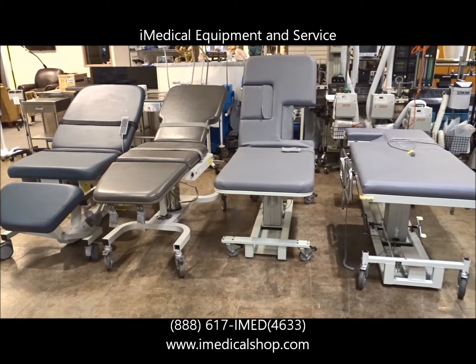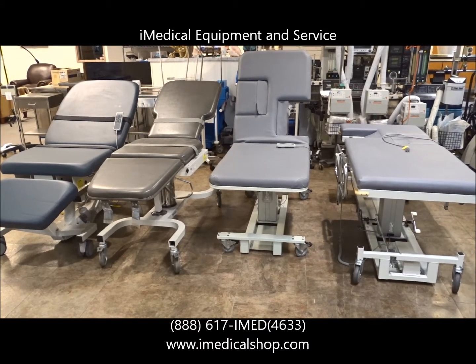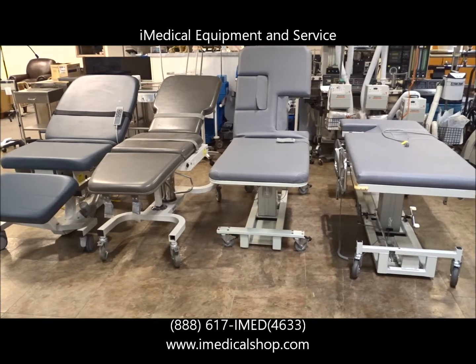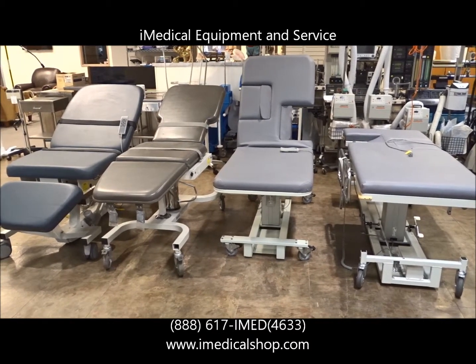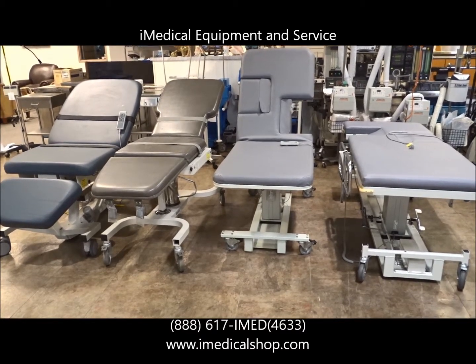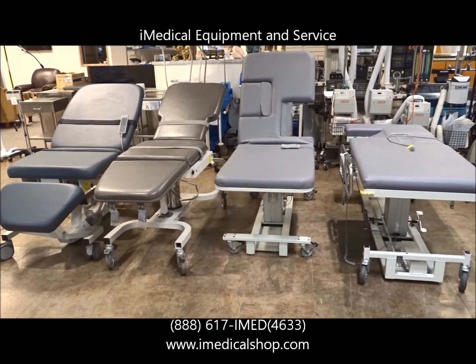If you're looking for ultrasound equipment, we carry a wide range of ultrasounds — both black and white and color, console units, portable units — everything you need for imaging equipment, everything you need for ultrasound tables, and everything you need for your medical practice. Give us a call at iMedical or visit us online at www.imedicalshop.com. iMedical Equipment and Service: your one-stop shop for all your medical equipment needs.